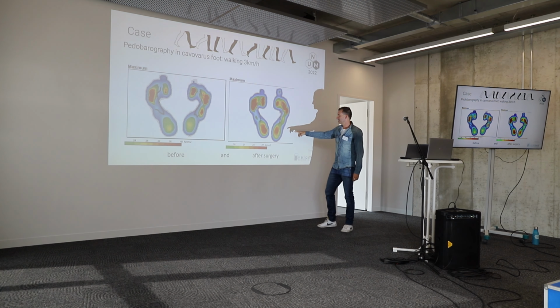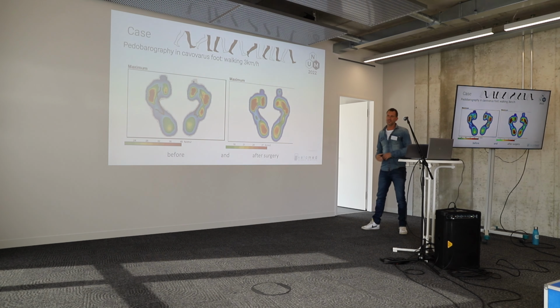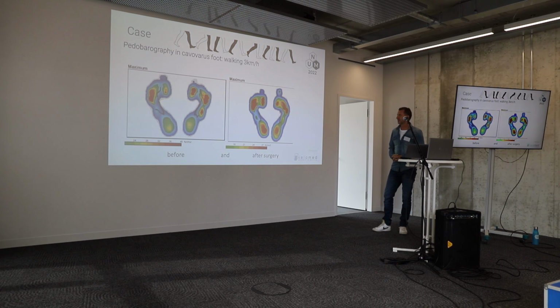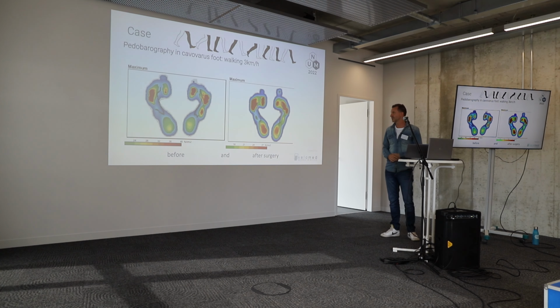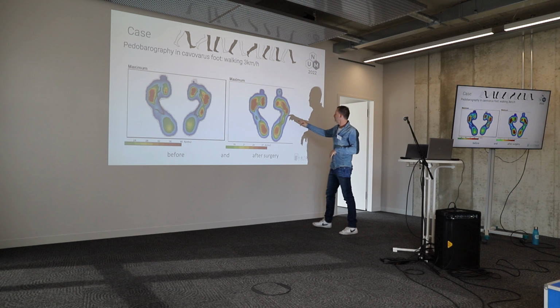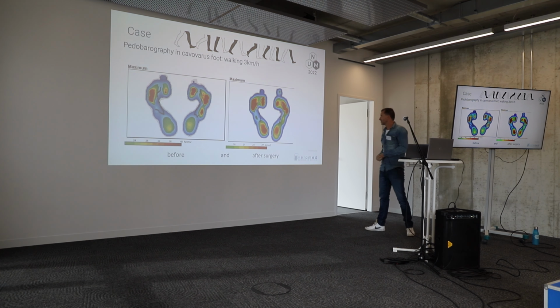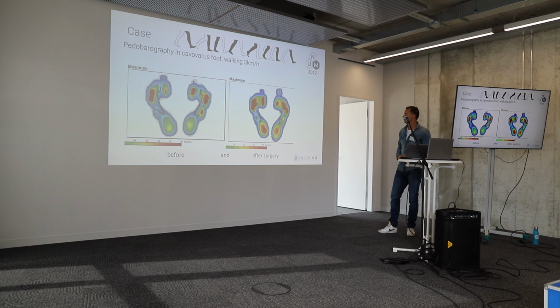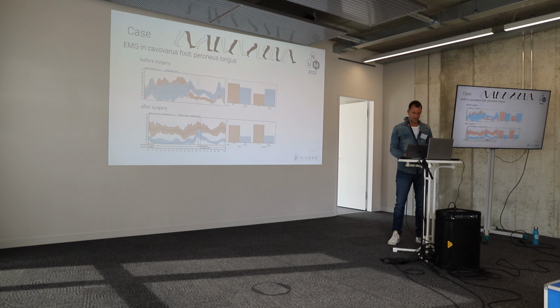And what is very, very interesting, we also see it on the left side. So that is a phenomenon you can see pretty often in these cases, that the non-operated side shows a kind of adaptation to what we did on the right side in the operation. You see a better and a more general distribution of the forefoot here in contrast to the left side. And what you can also see is that we have a pressure at the area of the great toe.